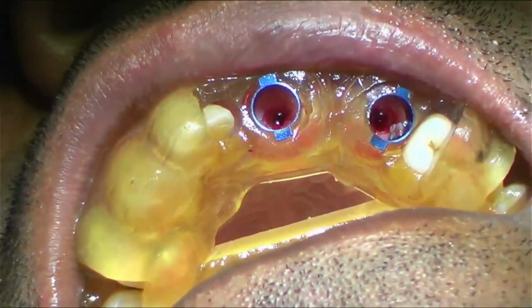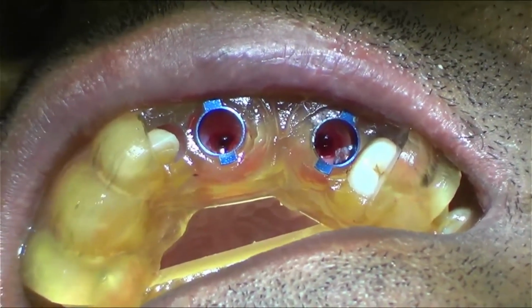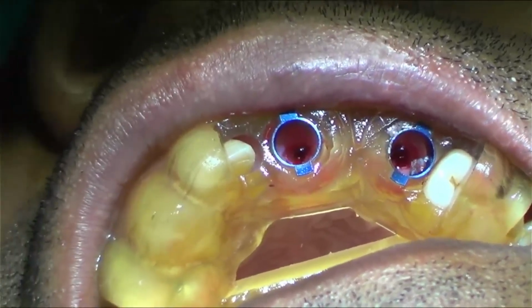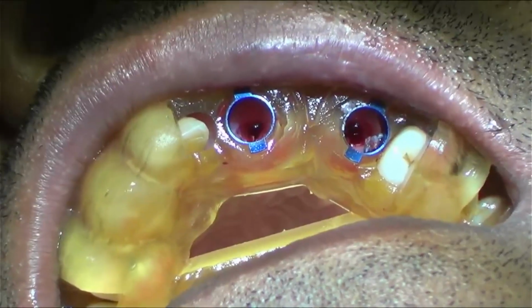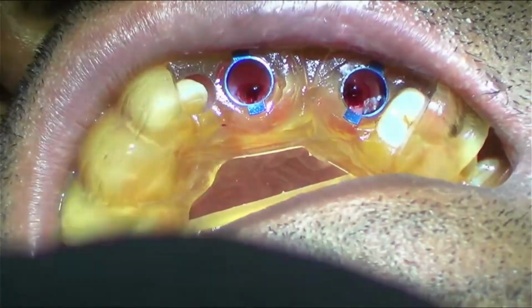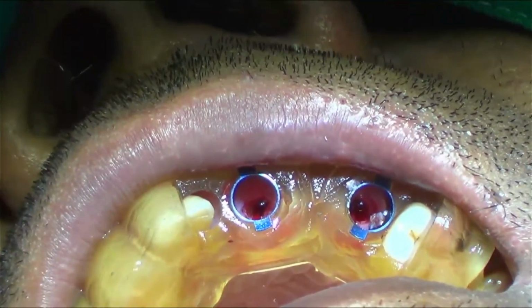Open it, sir. Implant mode. Implant mode is done, okay. So here I am taking up the implant.